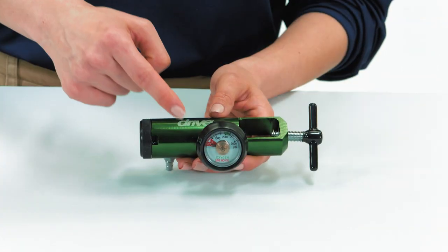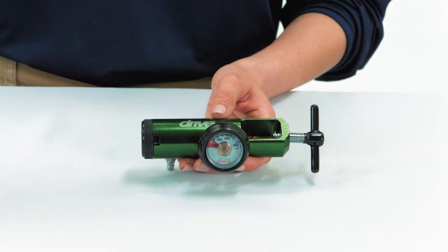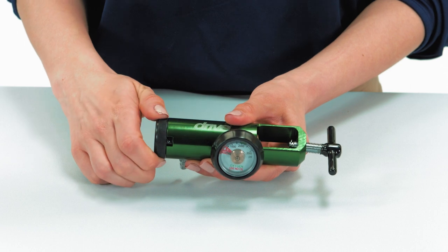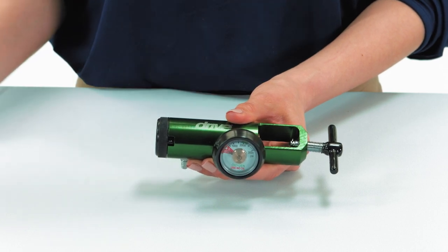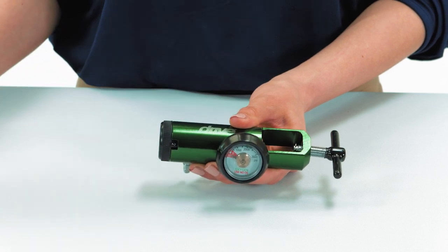The pressure gauge displays the remaining pressure in the cylinder. When the gauge reads in the red, be sure to change your cylinder. The flow selector will adjust the liters per minute provided through the regulator and into your cannula. This should be set by your equipment provider as prescribed by your physician.